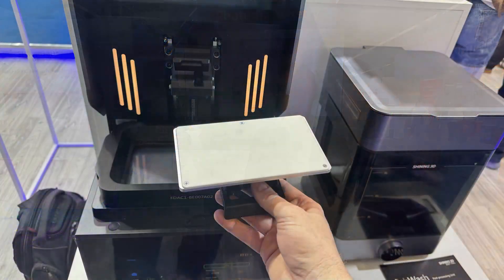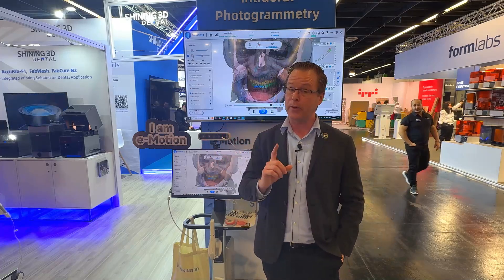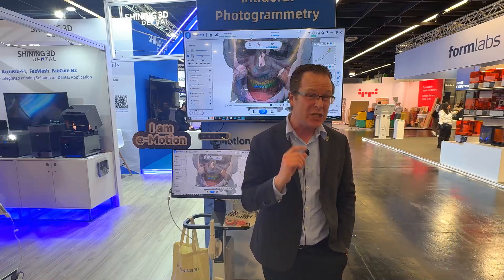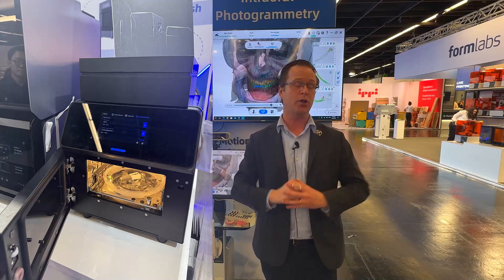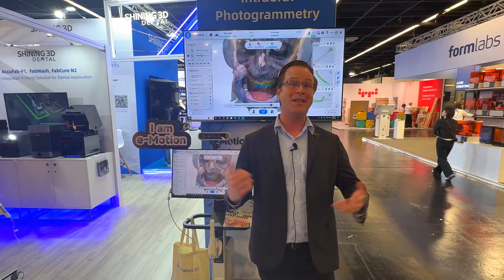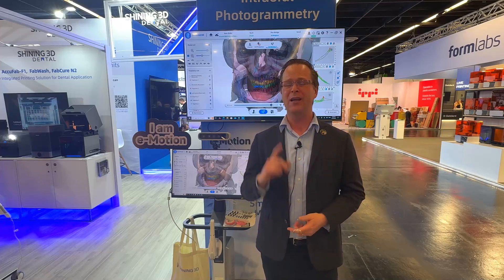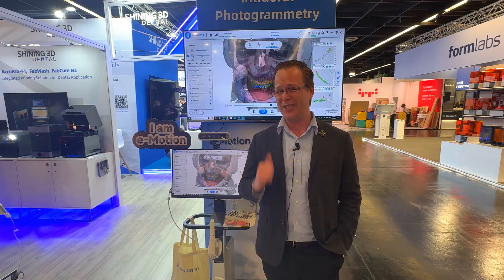This is Dr. Michael Scheer coming to you from the Shining 3D booth here at IDS Cologne. Not only do we have the eMotion setup with the Shining 3D Elite Wireless Scanner, but Shining 3D has brought some really cool 3D printing updates as well, including the AccuFab F1 — a DLP printer that's really effective, easy, and straightforward, utilizing an open workflow including Shining 3D resins and other outside resins. Additionally, a new nitrogen cure from Shining 3D. A powerful showing here from IDS Cologne. Go ahead and check out Shining 3D and some of the recent updates on my YouTube channel, coming to you from IDS Cologne 2025. Nice job, Shining 3D.